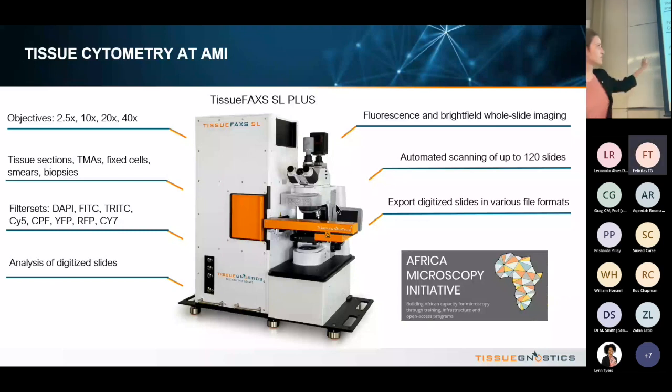And then the last part, which is maybe the most important, is the analysis of the digitized slides. We have 3 different softwares for image analysis. All of them are available here at AMI.